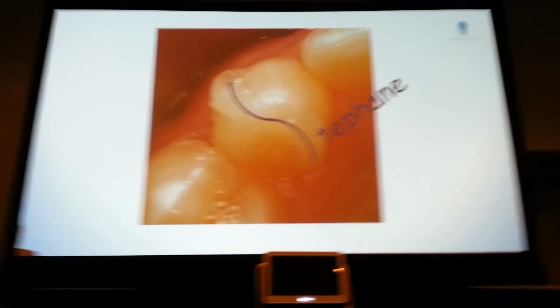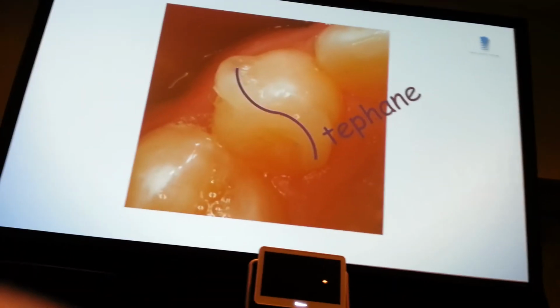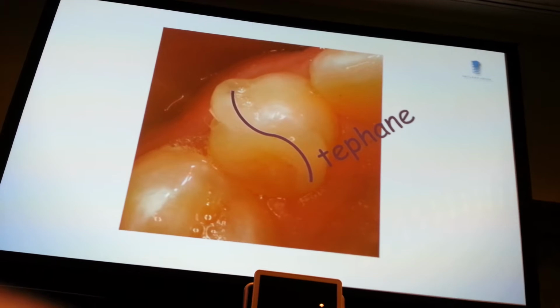So then you have two handles, and you're pulling the tooth out. It's going to be easier than having only one. If you're pulling only on one side, again, the tendency of the tooth will be to rotate lingual. If you have one on each side, it will go straight up.